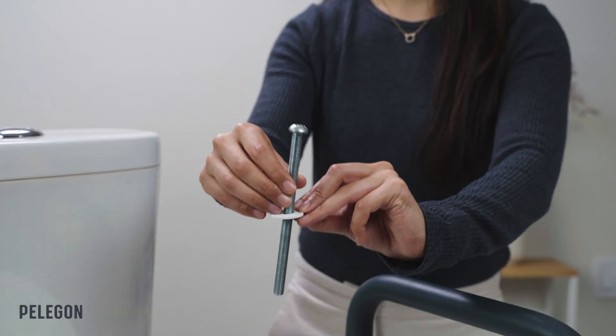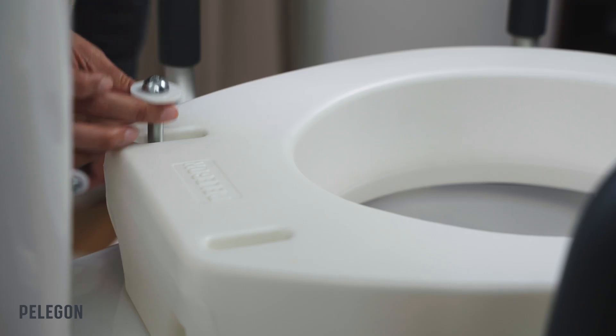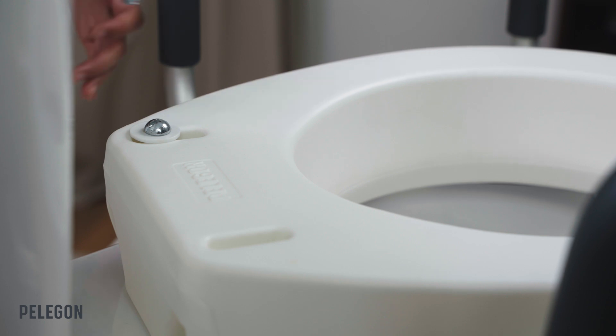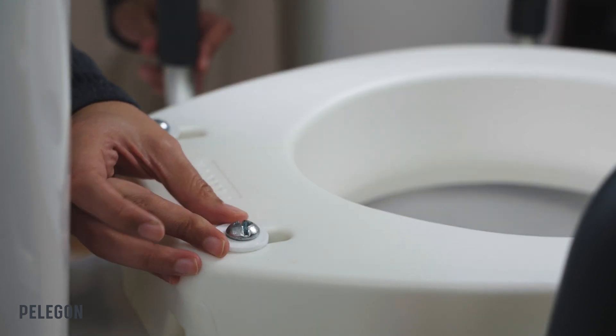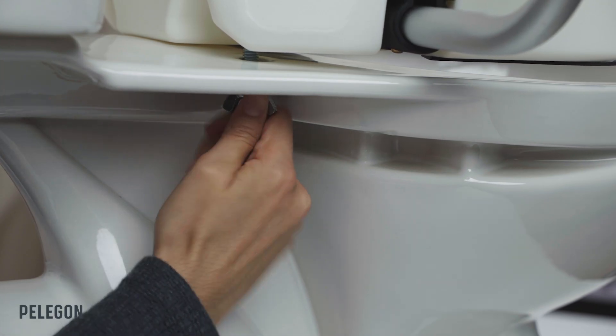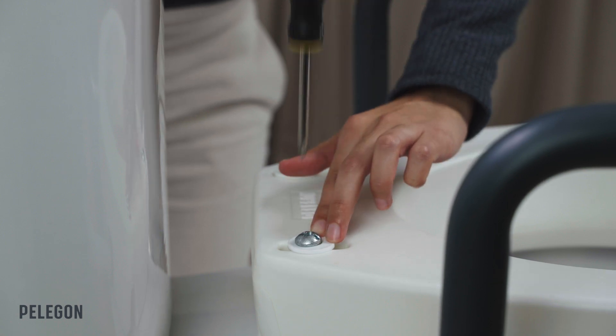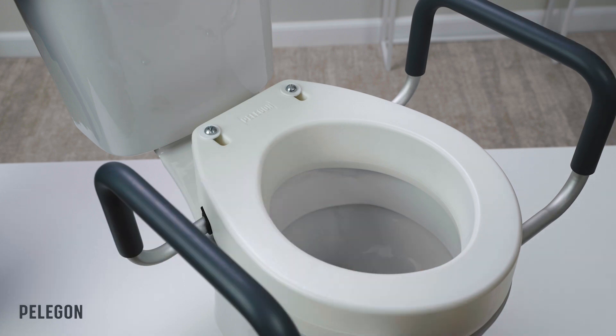The plastic washer should be attached from above and the metal ones from beneath. As you are attaching the seat, be sure to tighten the screws all the way and then check the seat stability before first use. If by any chance you feel that it's not properly connected, don't continue — you'll probably need to re-screw it to the base.